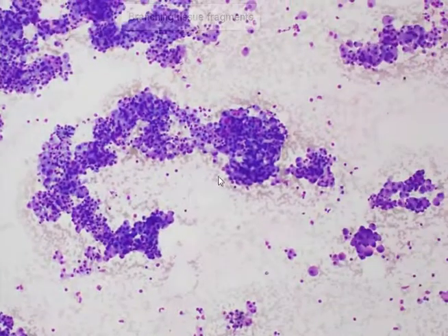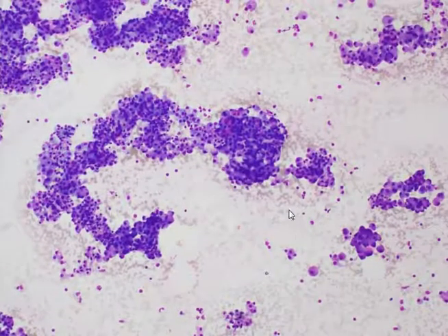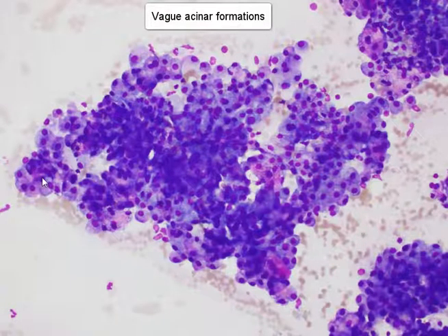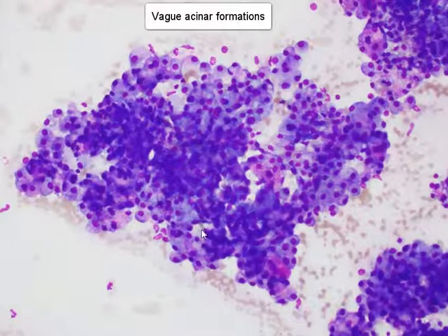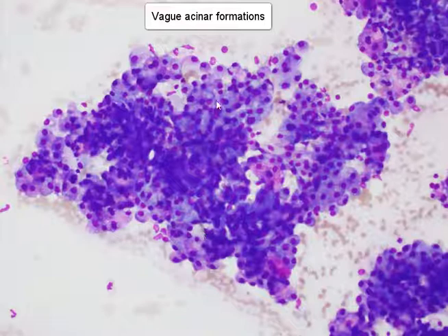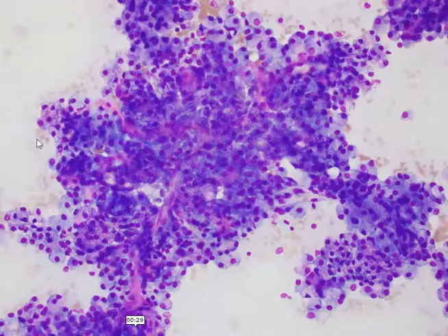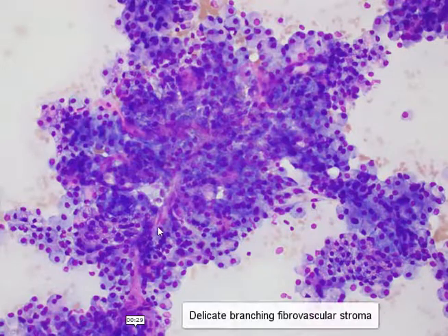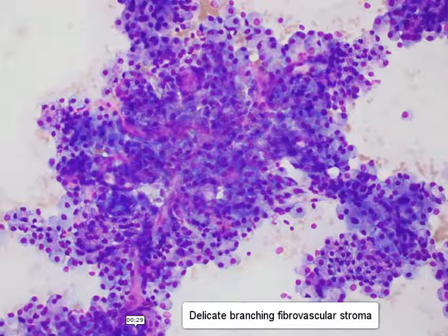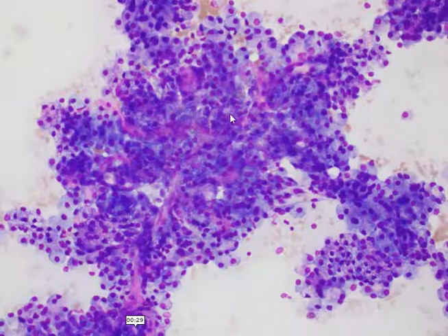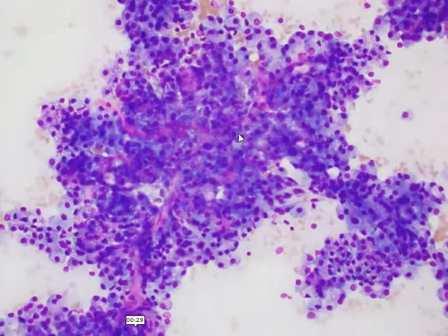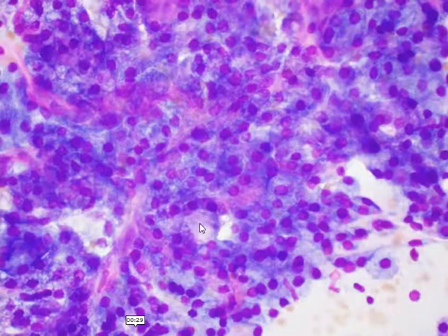We begin to see that there may be small acinar type arrangements of these lesional cells, and many of the cells exhibit low NC ratios. Some tissue fragments appear to have this fine branching pattern of stroma, perhaps thin capillaries or very delicate fibrovascular stroma running through the backbone of these tissue fragments. The lesional cells are very closely and intimately associated with the stroma.